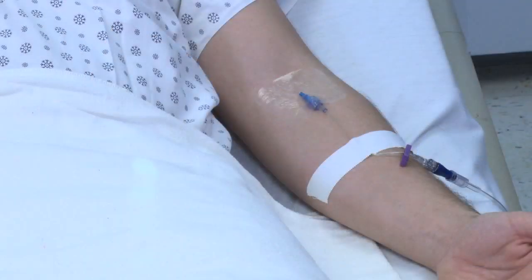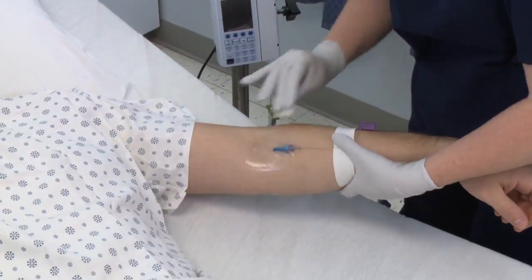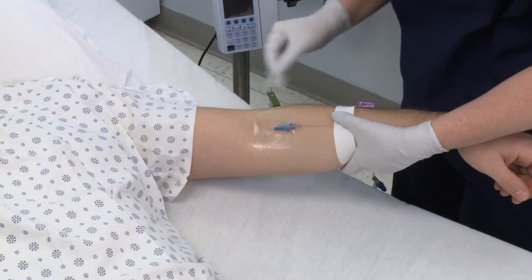Begin by securing and dressing the IV line according to your hospital protocol. Apply skin prep to the areas where the adhesive will be placed. Allow approximately 30 seconds for the skin prep to dry.